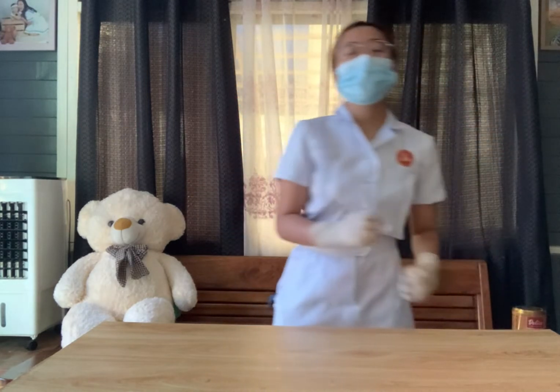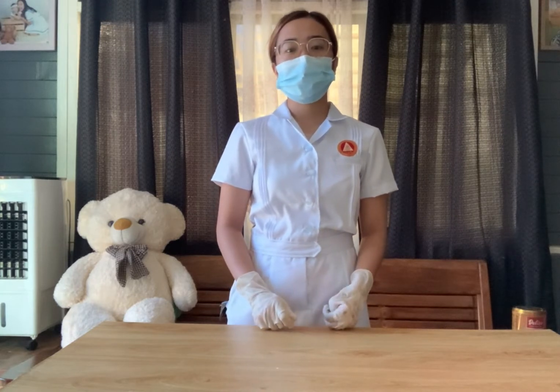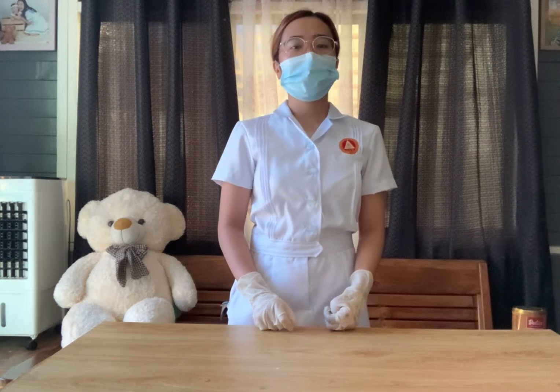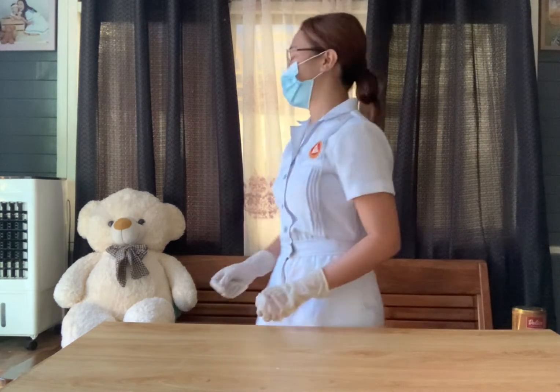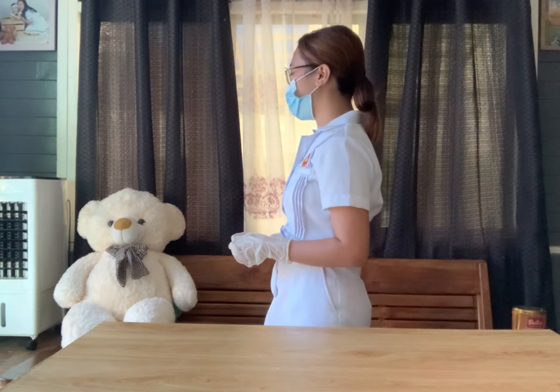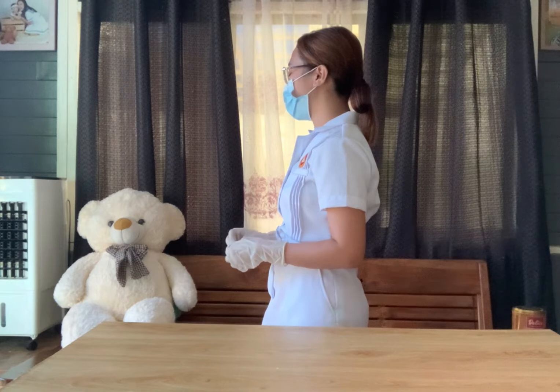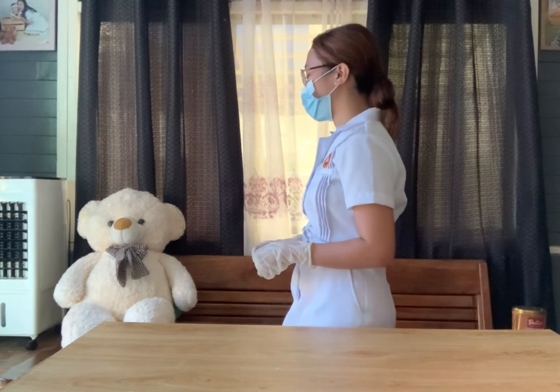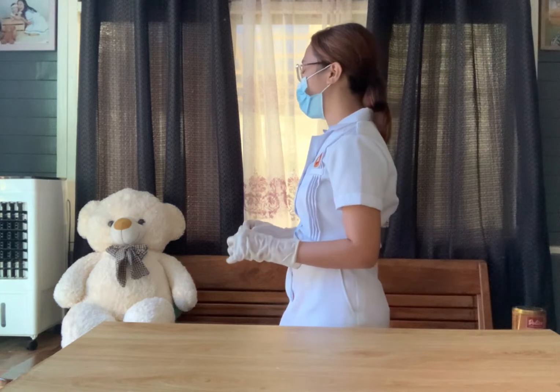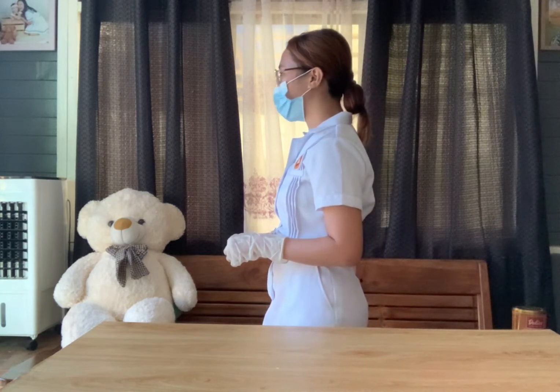After that, prepare the place as well as all the materials needed throughout the procedure. For the implementation, you need to establish rapport. Good day, Ma'am. I am Koyorime Amisidro, a student nurse of this hospital. I will be performing the urinalysis using Benedict's solution, which will help us detect if there is any presence of glucose in your urine. Is that okay with you, Ma'am?